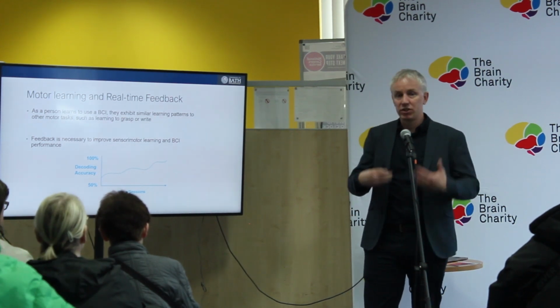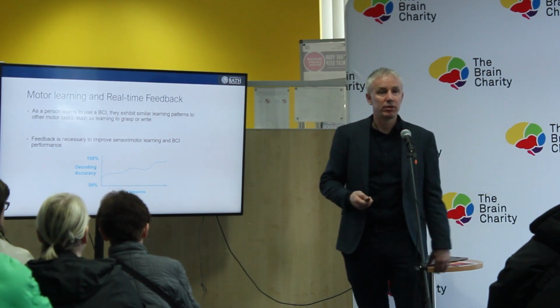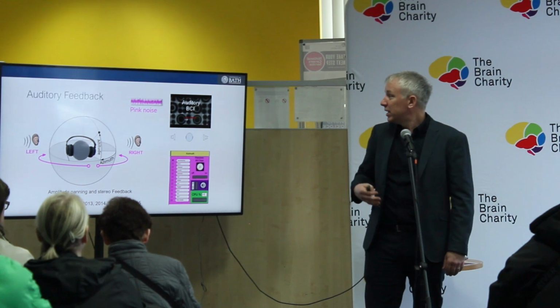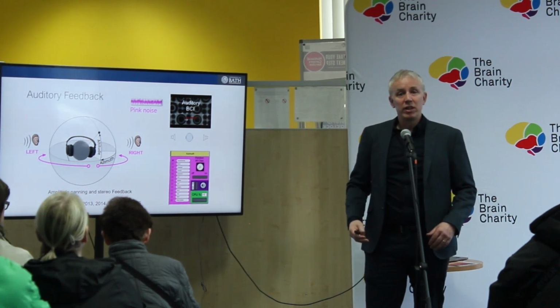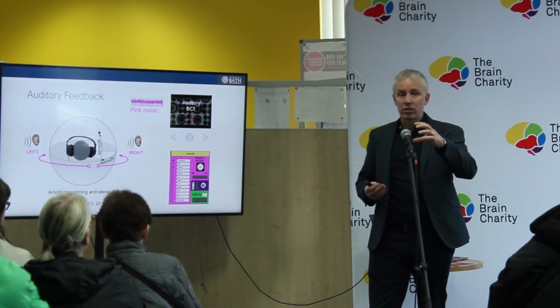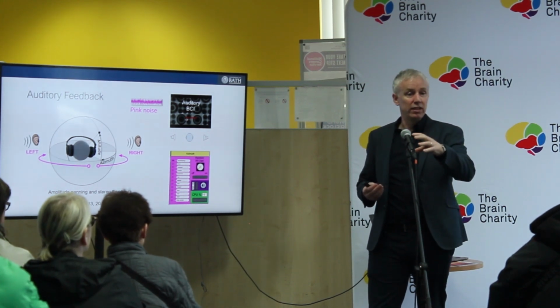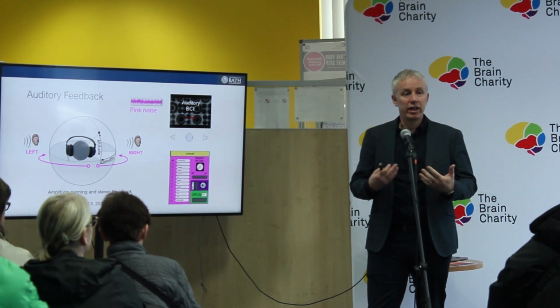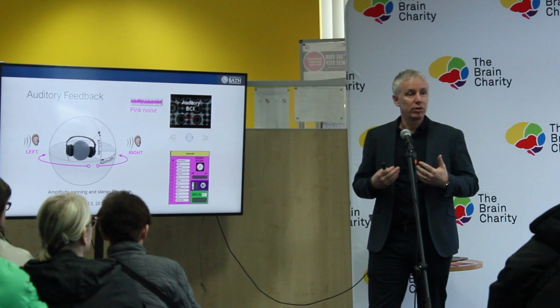We want to get the accuracy up so that they could use it for something functional like communication or controlling a robotic device. So we also use auditory feedback. The importance of the games is you're given visual feedback. When you learn to grasp a toy as a child, if you didn't see the toy and you didn't have tactile sensation, then you would not learn how to grasp it. It's the same with brain-computer interface.